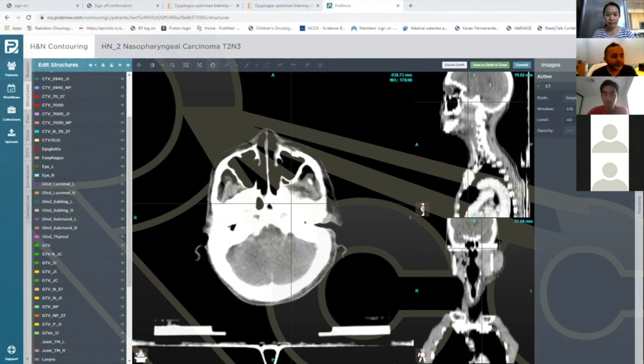But on average, the average parotid gland should be somewhere between 30 and 35 cc's. So then you want to look at how much of that gland you are sparing. When I look at the parotid minus PTV volume, we call it our parotid OAR volume, if it's 2/3 or higher, you've done a good job of sparing the gland, right? That's what I typically look at. Versus, say, in an atrophic patient where their gland is 15 cc's and the spared gland is 3 or 4 cc's, clearly over 2/3 of the gland is being irradiated to a high dose. You're not going to spare salivary function in those patients.